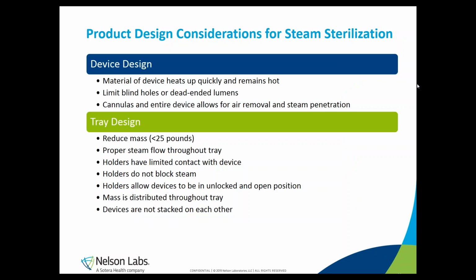It's also important to consider the challenges that long lumens, areas of high material density, mated surfaces, for example, but also assembled pieces and dead space create for the sterilization process.